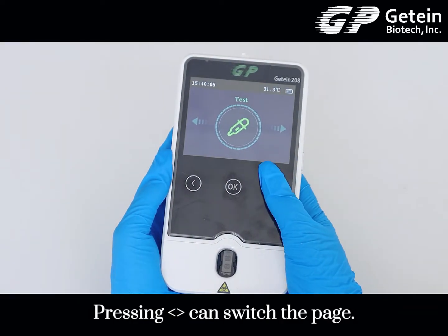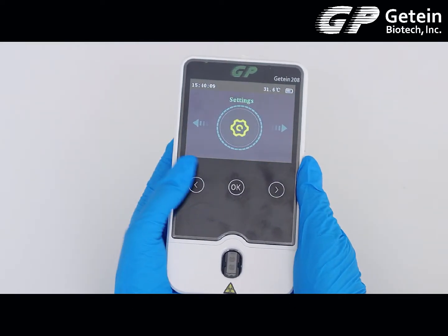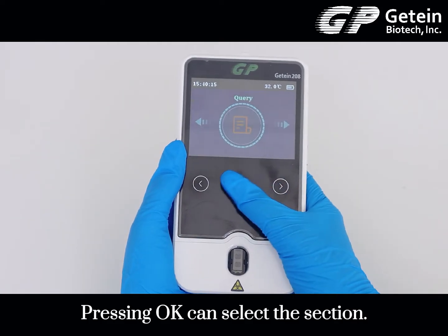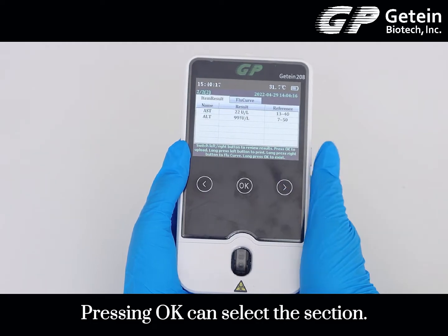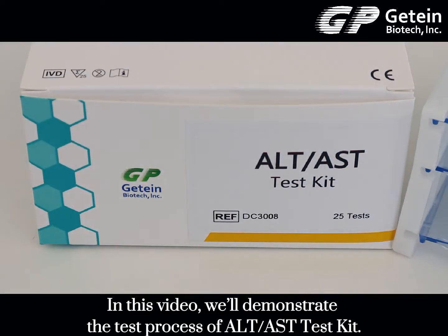Pressing left and right can switch the page. Pressing OK can select the section. In this video, we will demonstrate the test process of the ALT and AST test kit.